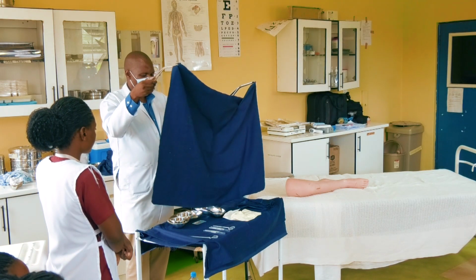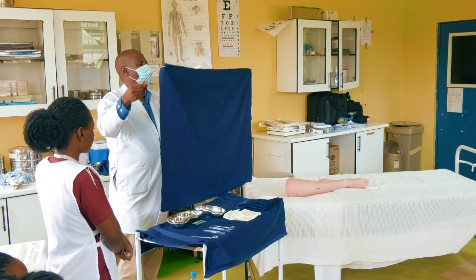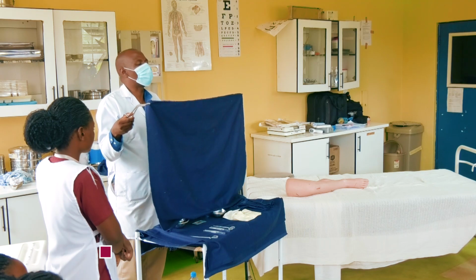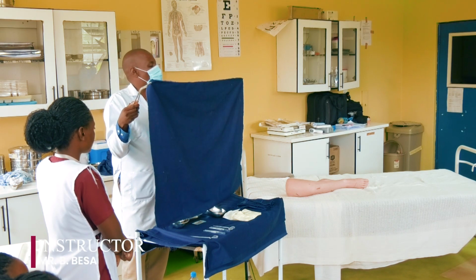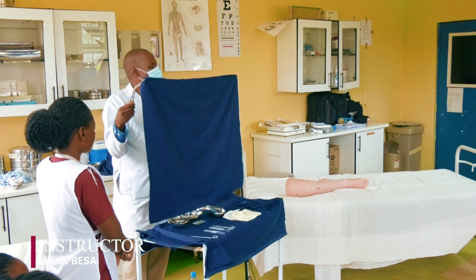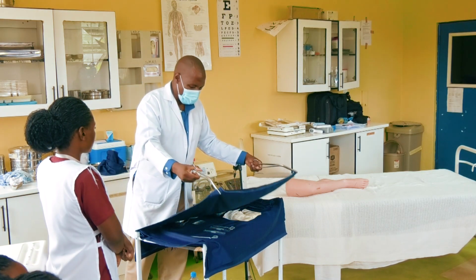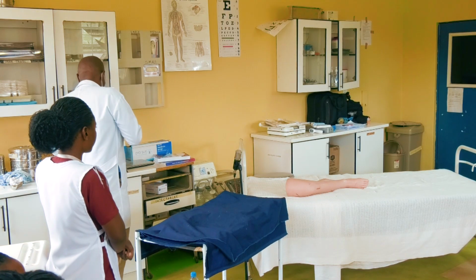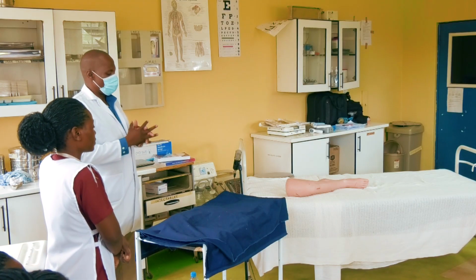So see the reason that you're supposed to do this. I've opened this, which part is more sterile? The one that is closer to me or the one that's away from me? So that's the part that is supposed to go in touch with the sterile equipment, right? So I can cover like that. Okay? So done. Then we'll get to the patient.